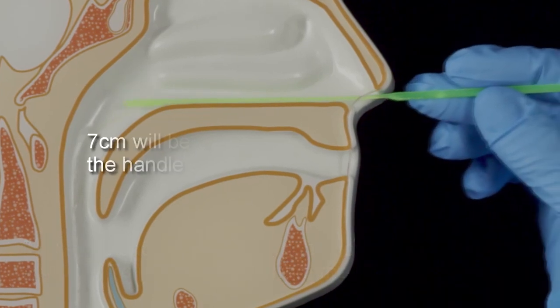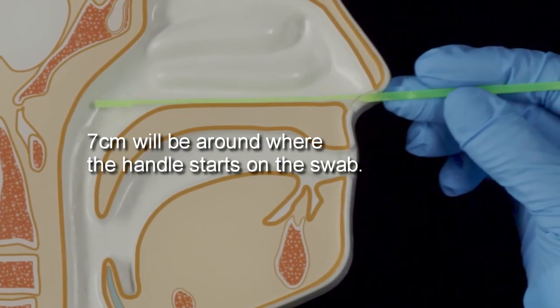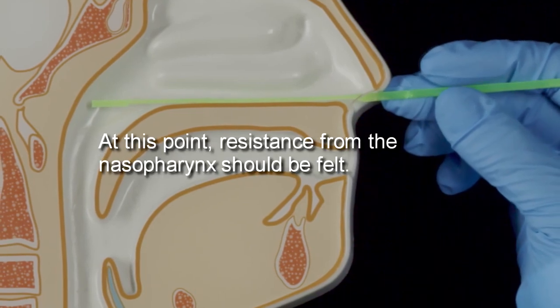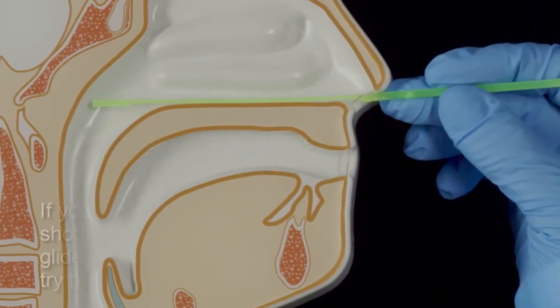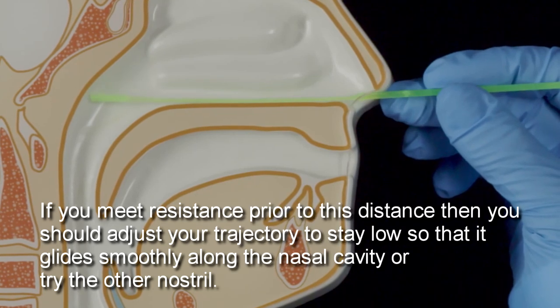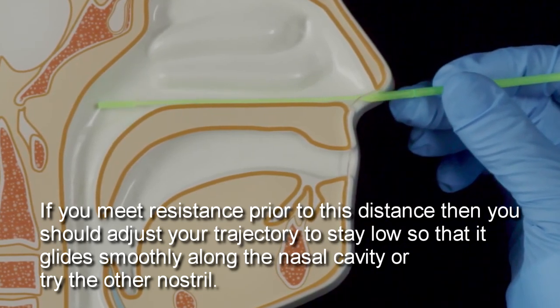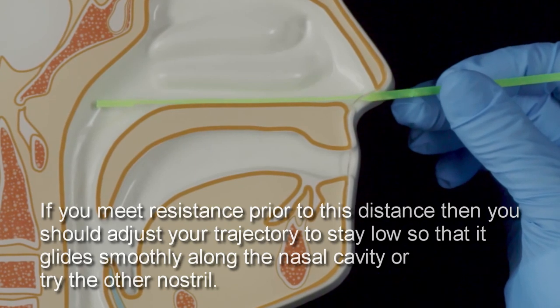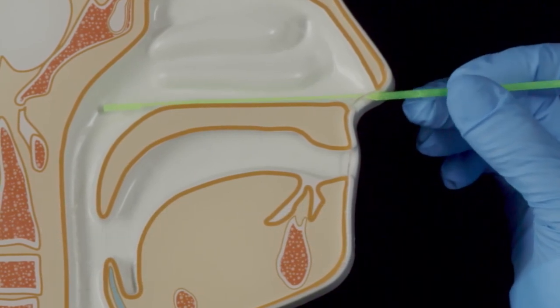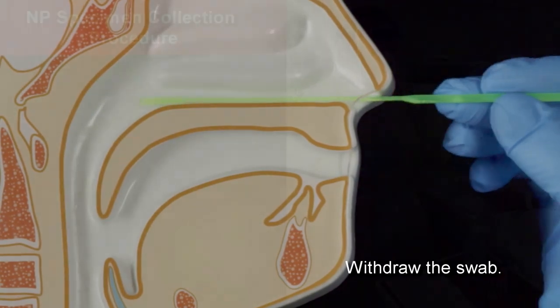Remember that seven centimeters will be around where the handle starts on the swab, and at this point resistance from the nasopharynx should be felt. If you meet resistance prior to this distance, adjust your trajectory to stay low so that it glides smoothly along the nasal cavity, or try the other nostril. Rotate the swab a few times to collect the cells, then withdraw the swab.